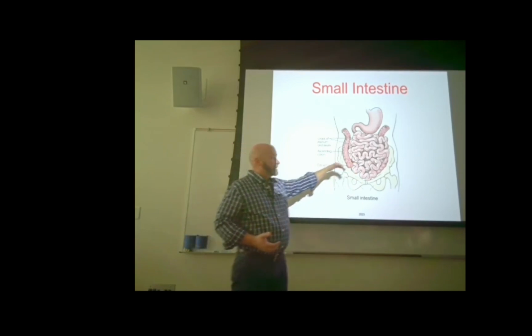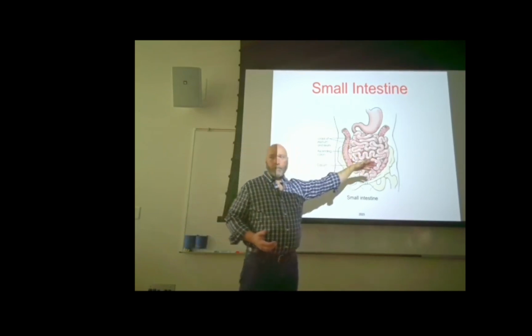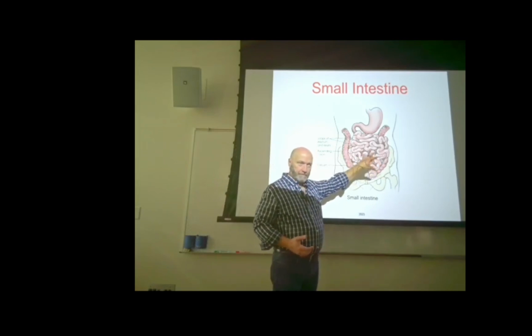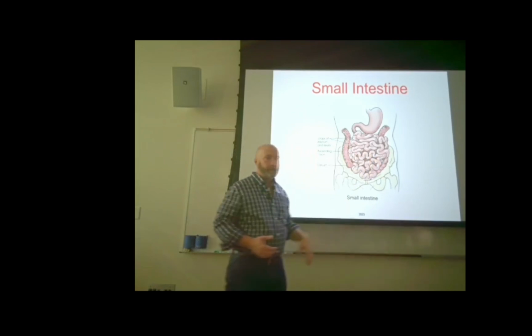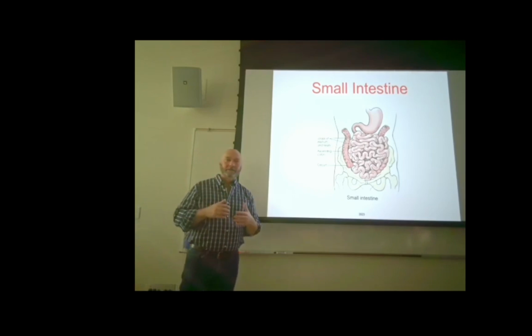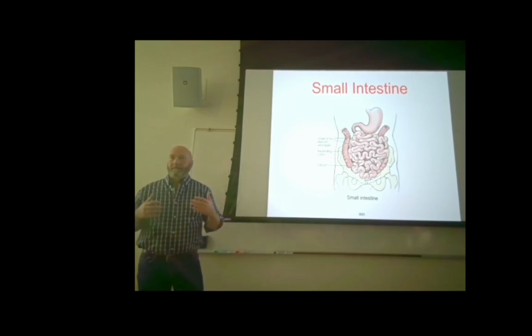What you're going to see in the small intestine, at least in the first portion of it, before all that contrast gets down into the distal jejunum and the ileum, is the contour of the small intestine, and the inside looks kind of fuzzy, all right?